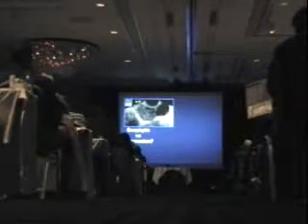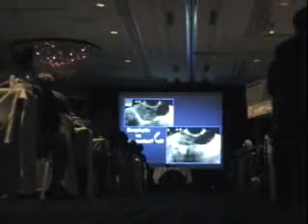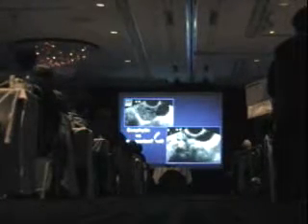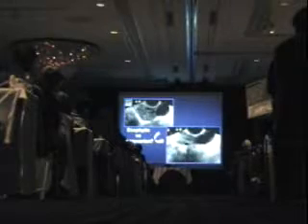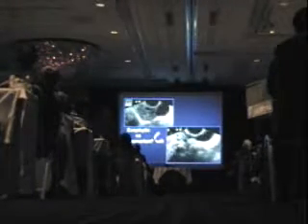The main thing is, when I look at something, to know, is this part of the ovary? Because from the size here, if it was ovarian, I would probably want to follow this woman. Whereas if it's extra ovarian, I would suggest it's something I wouldn't worry about. So what am I going to do? I'm going to, again, probe with the probe, and here very nicely, I think you can see that we are separating these two, and therefore this becomes a para-ovarian cyst. Nothing to worry about. It's small.